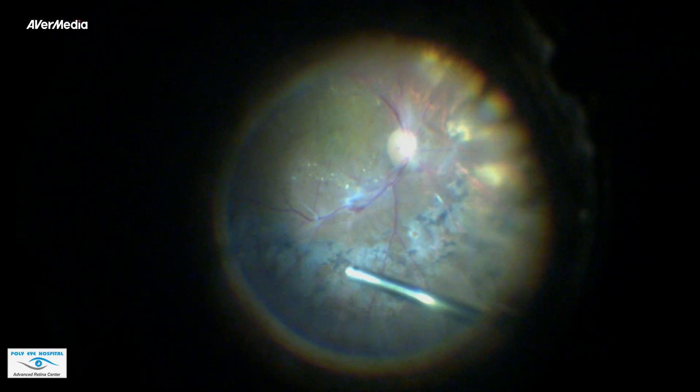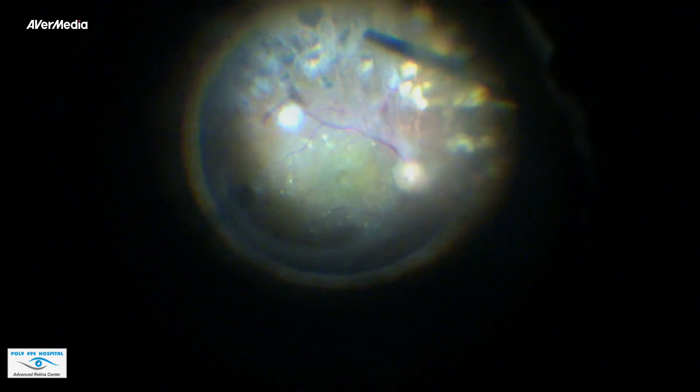This is a case of chronic macular edema with focal tractional detachments. Vitrectomy with ILM peeling was done. This video describes the importance of identifying second membranes and also the technique to peel ILM in edematous retina without causing any foveal tractions.